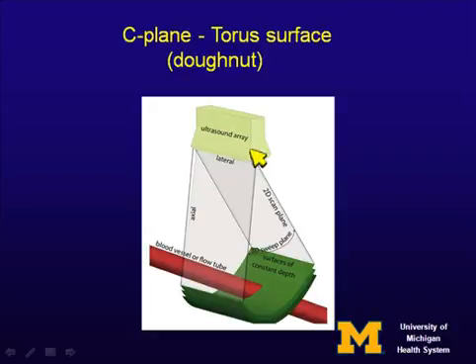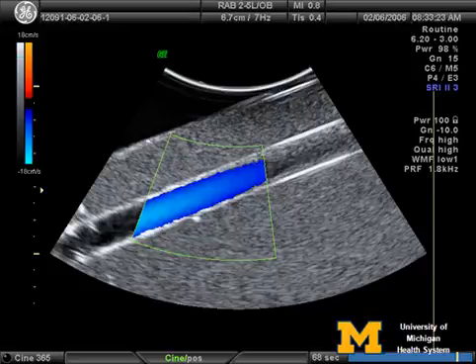If you now scan with this technique, you can use multiple planes through the blood vessel. All you have to do is cut the vessel with multiple surfaces. So since this is volume flow, if there's no branches coming off, blood is conserved, so you can make multiple measurements. So you can get very robust statistics by scanning the flux across a whole bunch of different surfaces going through the blood vessel.